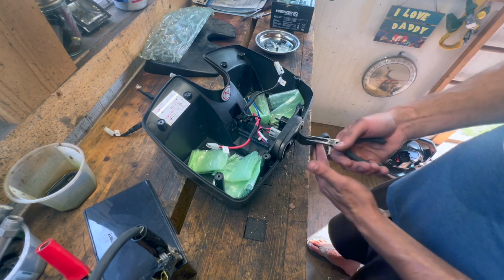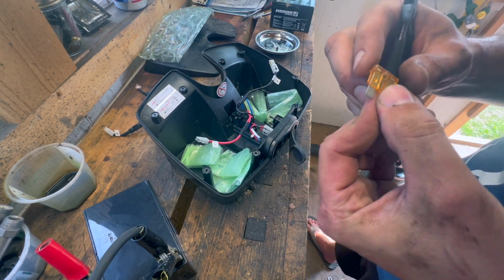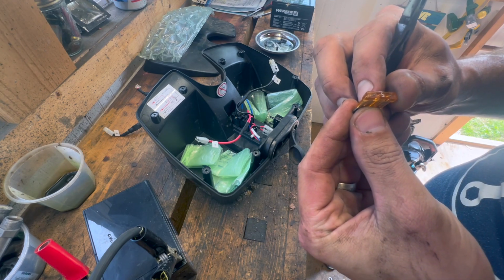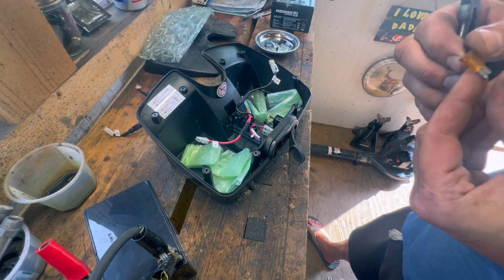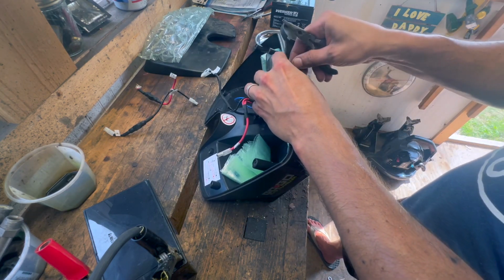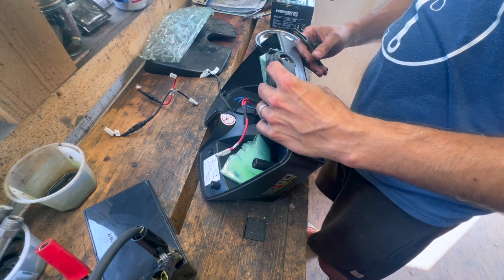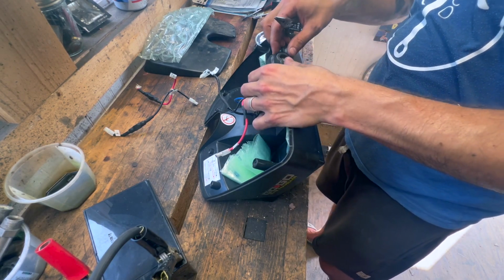Just to double check, let's... Yeah, that's fine. So I think I'm gonna let these attempt to charge. We'll see.